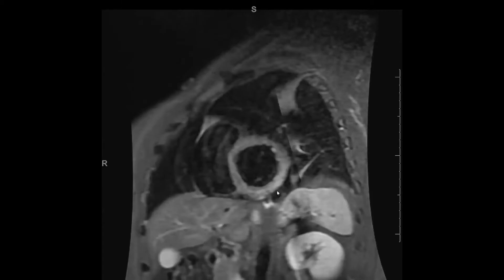For those who don't look at a lot of cardiac MRI studies, this is a short axis view — essentially cutting through the heart. Like cutting through a donut, this is very similar to cardiac SPECT imaging. If the LV were a person, these are essentially axial slices through the LV.